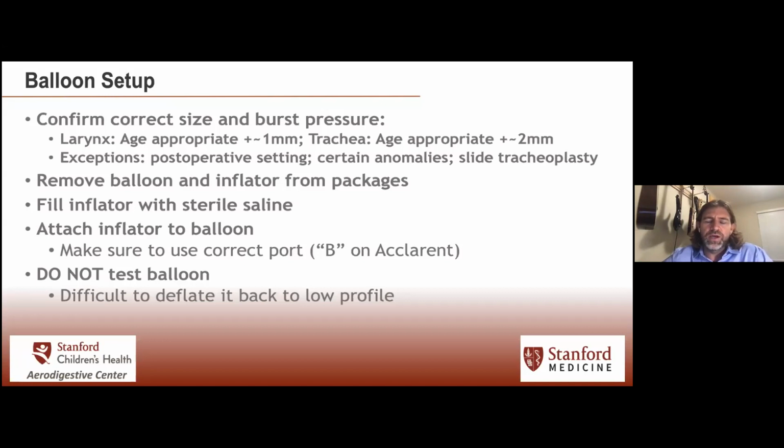You take the balloon out, make sure that almost every balloon comes with a cover on the balloon. I've had those handed to me with the cover still on. It's obvious, but I guess theoretically you could stick the balloon in there with the cover on, and that's not going to work. You've got to make sure that the nurse has, or you have the inflator with sterile saline hooked up to the correct balloon port, and do not test the balloon, because these balloons are nice because they come very wrapped. And if you test the balloon to blow it up and just show that it works, it's really hard to get it down to that crimped profile again.